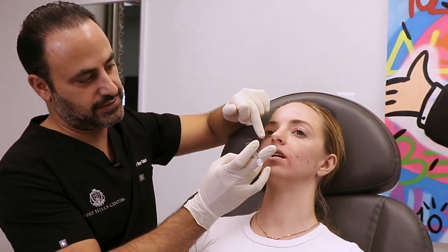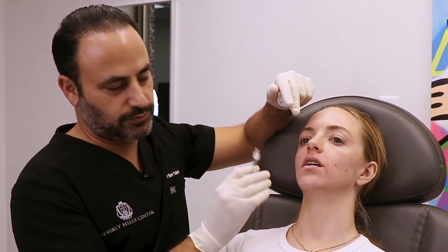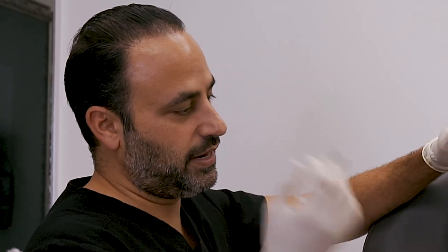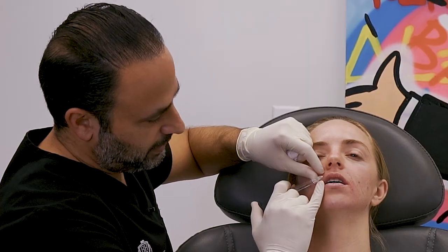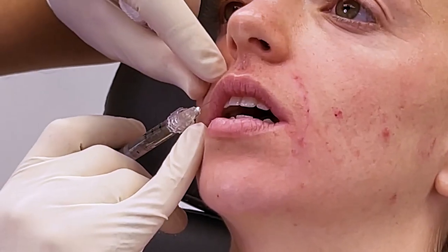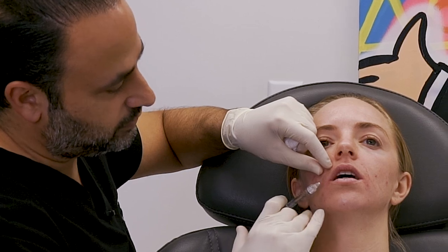You don't want to fill the vermilion border in most people because the second you do, you've put filler into the philtrum. The lamina propria — the level under the mucosa and submucosa — is directly connected to the SMAS, which is the layer under the dermis here. Same exact layer, no border, even though we see a color difference. So the second you inject there, it goes up. With products that migrate like Juvederm, it ends up going about 10 millimeters; silicone goes about two centimeters. Her lip has very nice height in the middle but she gets a little M-shaped lip — missing volume in the paramedian area.